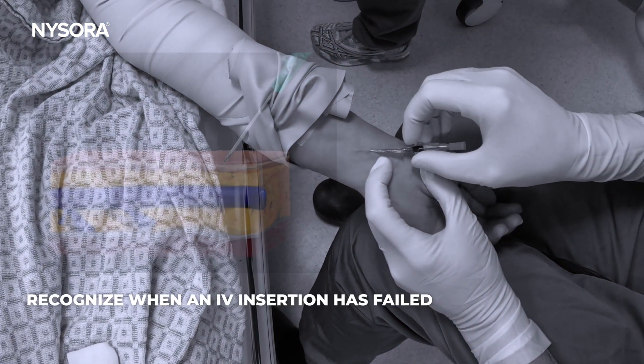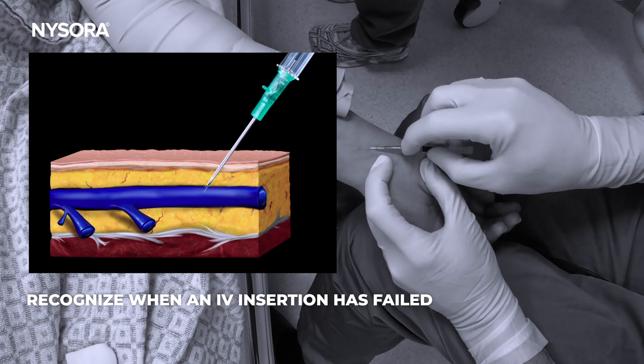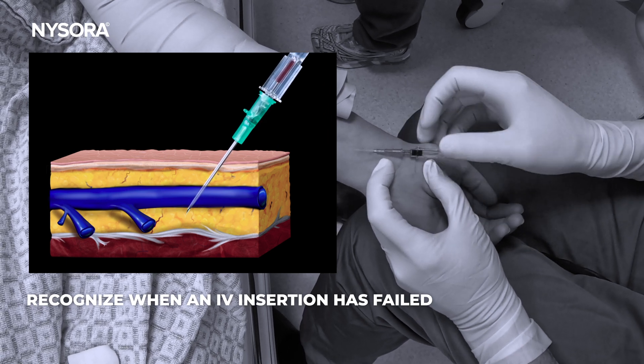I have done just what I wanted to avoid. Embarrassingly, I just did the mistake I was trying to avoid. My needle and catheter went through the posterior wall of the vein, ending up with the catheter in the subcutaneous tissue instead of inside the vein.